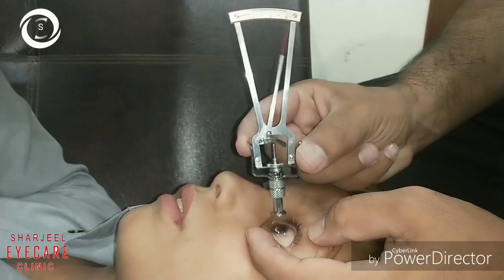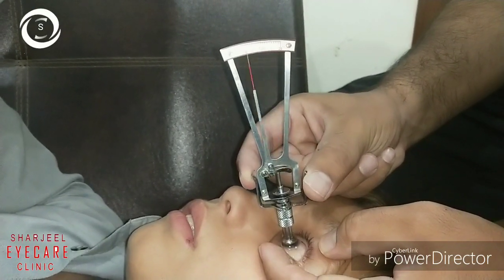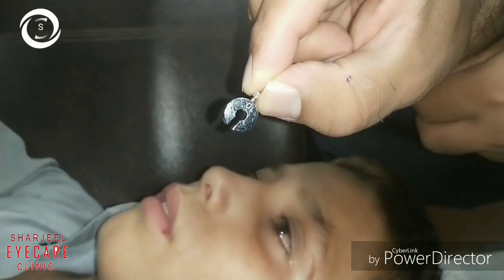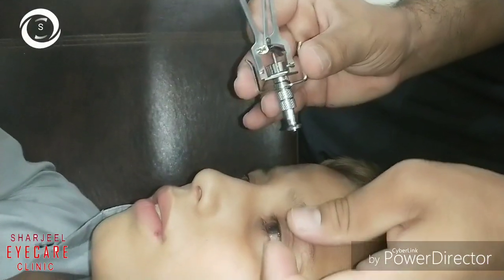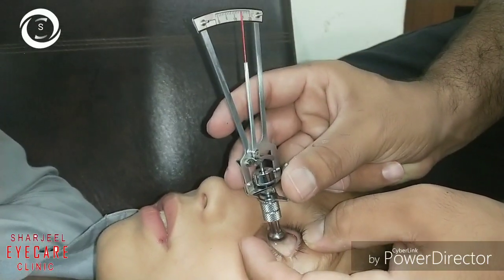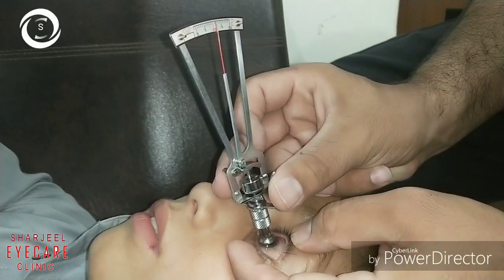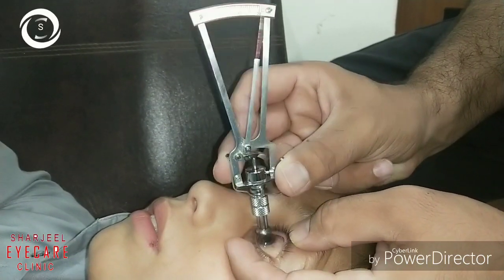With the tonometer pressed on the left cornea, the scale shows five. Elevate it and gently put it again a few times — if you are performing accurately, the reading will be the same. Here, the reading comes to five repeatedly. Now putting the 10-gram weight into the plunger and taking three or four readings, the scale reading is coming 11 or 12.